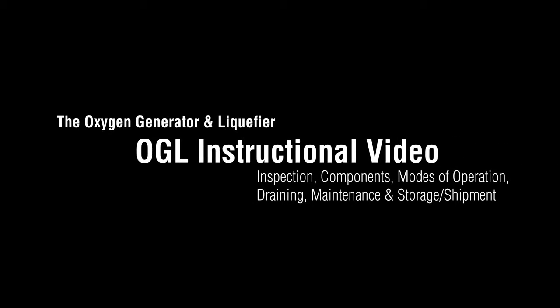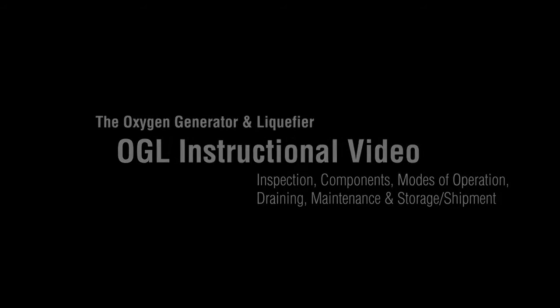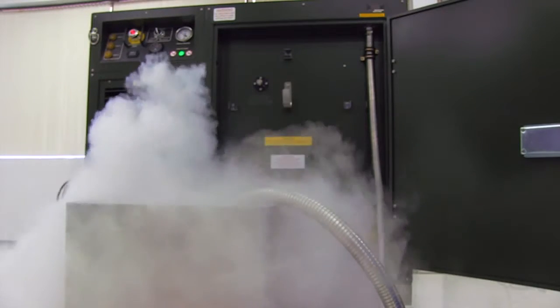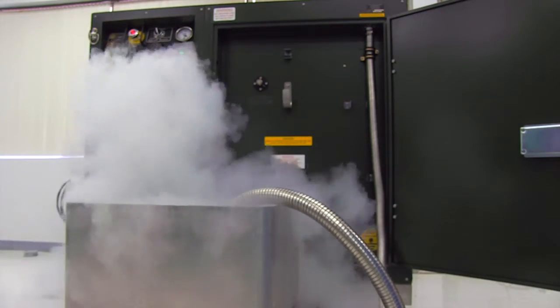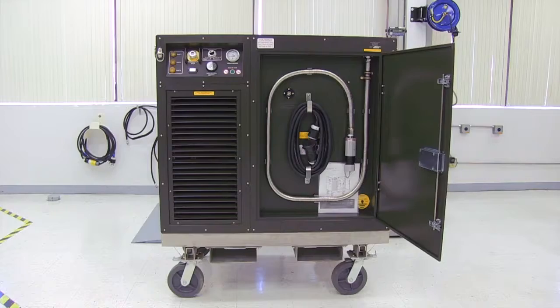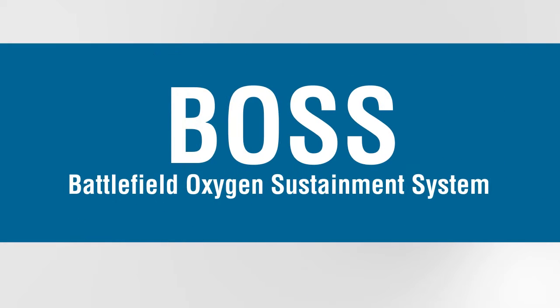The oxygen generator and liquefier, or OGL, is a portable liquid oxygen system capable of generating 93% USP oxygen and converting it into liquid oxygen at approximately 1 liter per hour. The OGL can store up to 40 liters of liquid oxygen in its onboard storage tank, which can be transferred into portable LOX devices, such as those in the Essex Battlefield Oxygen Sustainment System, or BOSS.